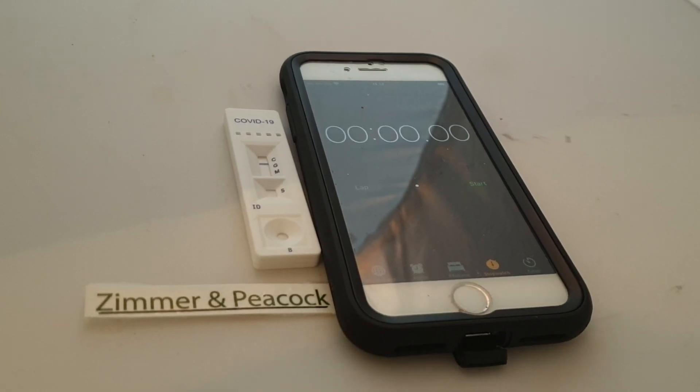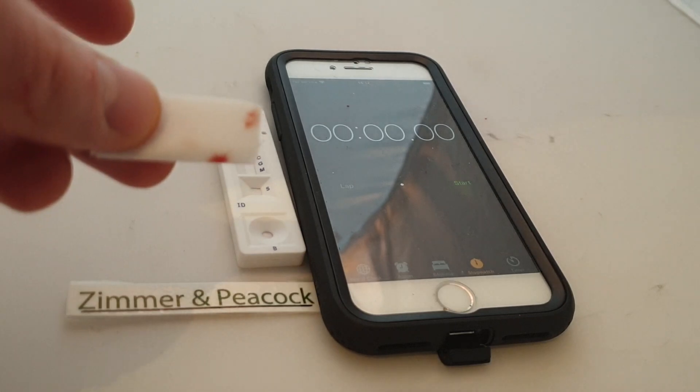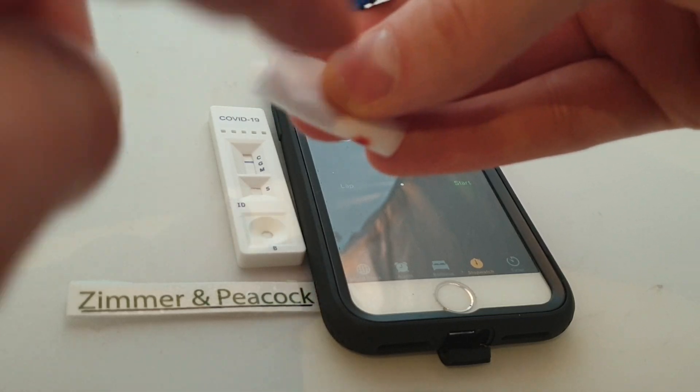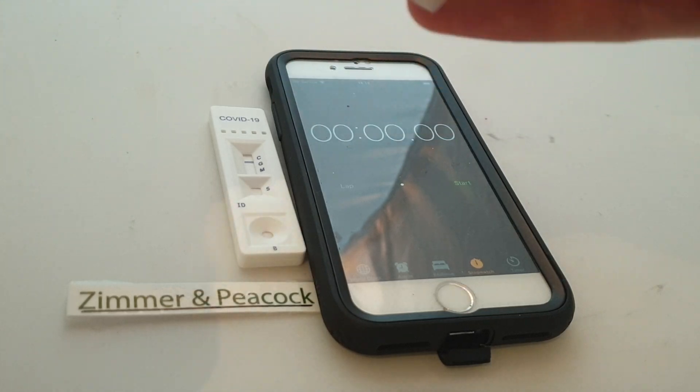In an earlier video I showed the unpacking of this COVID-19 test. What I'm now going to do is — with the kit come some alcohol swabs. I've just been trying this out on my finger as it is, but now I'm just going to clean up a little bit.